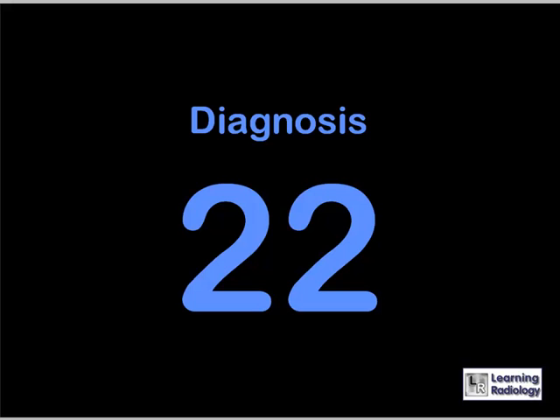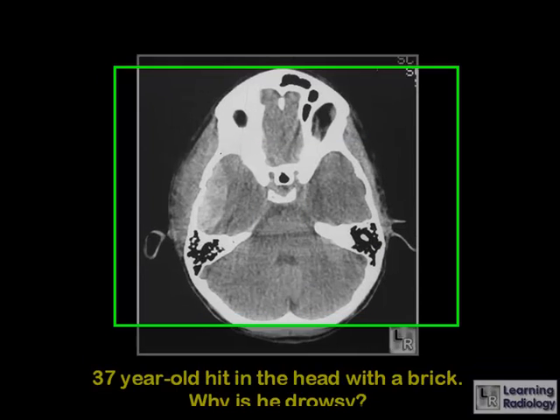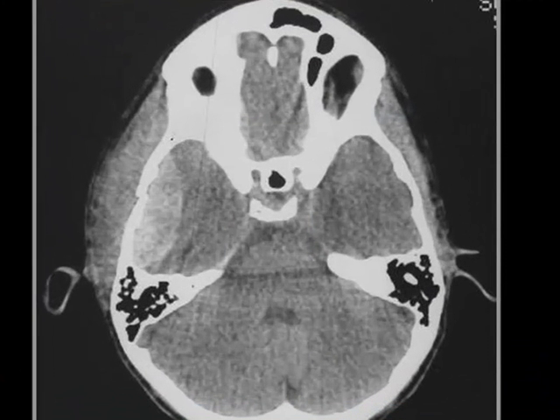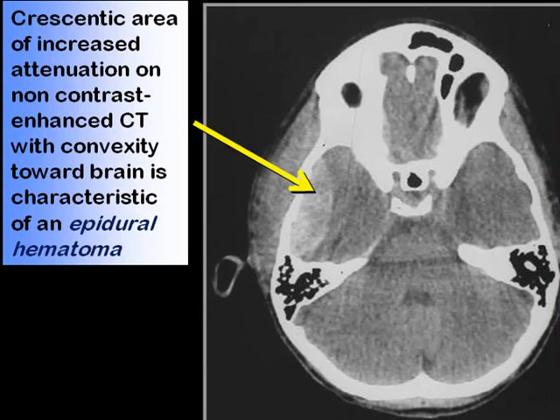This is a 37-year-old who was hit in the head with a brick — why is he feeling drowsy? The yellow arrow points to a crescentic area of increased attenuation on non-contrast enhanced CT, with convexity pointing toward the brain, characteristic of an epidural hematoma. This person also has a large scalp hematoma, to which the red arrow is pointing.